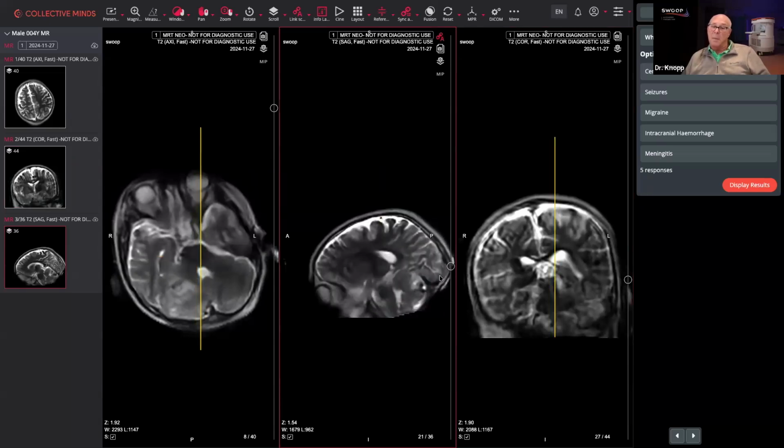Interestingly, this keeps catching my eye, as does this. And people are a little more hesitant in answering. Let's get the last of the... My sense is we have a solid group of people who answer questions, and everybody else is sitting back and watching. Let's take a look at the results.